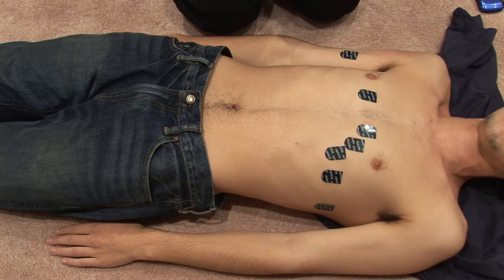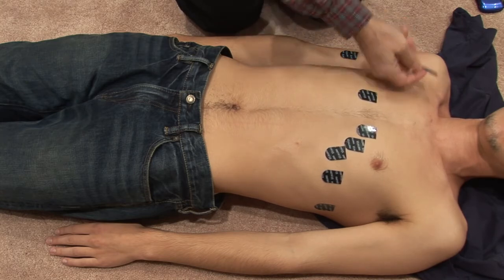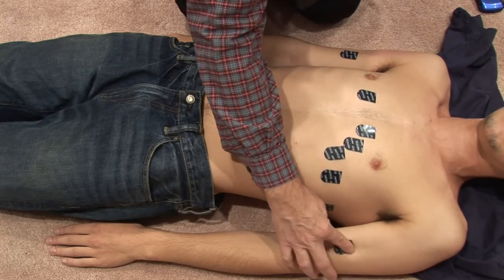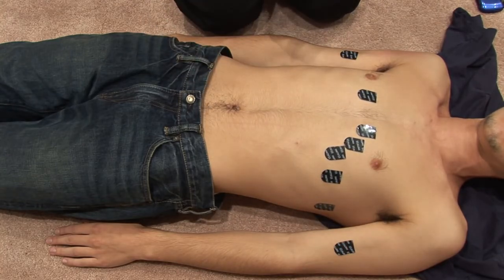Now, what about the arms? Well, the arms are easy. You want one on each arm. And you'll see some people in the ICU, they'll put their leads on the chest wall, but that's usually not the best place to put it. You should, if you're doing a formal 12 lead, you should put it on the arm.